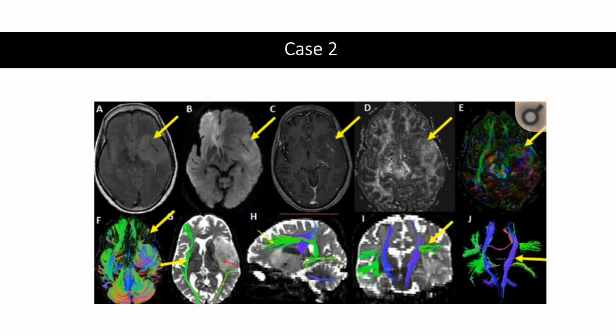Pre-operative DTI was completed and demonstrated the relationship of the lesion to eloquent areas to allow maximum tumor resection and to avoid tumor recurrence and damage to vital areas, such as the language and motor function of this female. Axial whole brain tractography showed destruction and distortion of left frontal fibers and the left IFO tract.